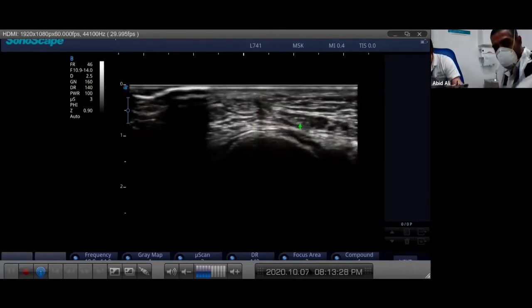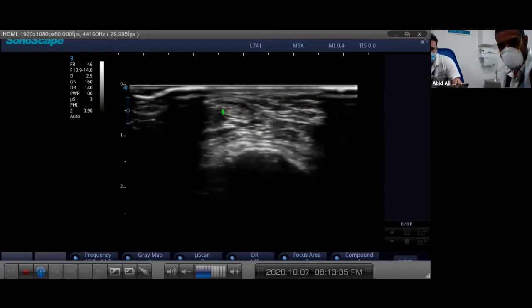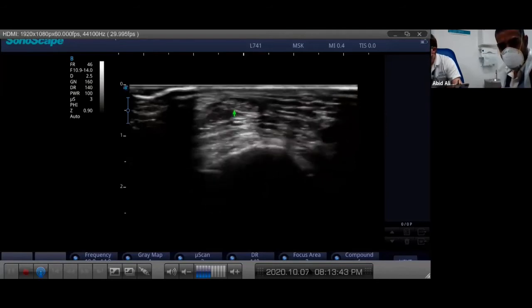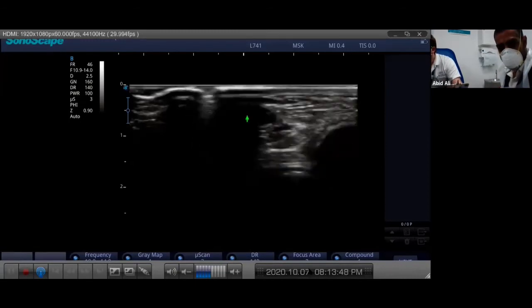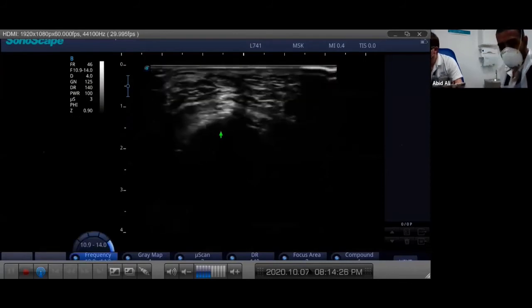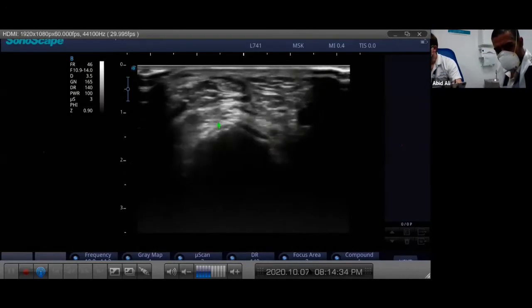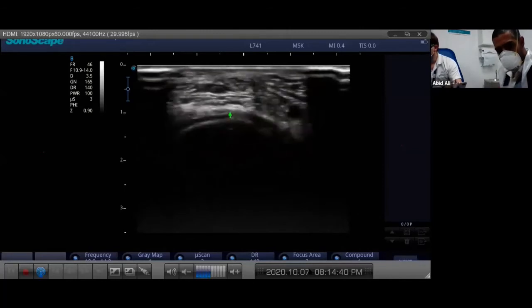To keep on it you're not going in a straight line - you have to follow the contour of the foot as it dips down under the navicular. You can see it thinning out and broadening as it gets closer to the insertion. Keep that in the middle of the screen. Keep very very little pressure on your probe here - if you fall into the deep blue sea and can't see it, go back to where you picked it up, get it back in the center, then follow it up again.